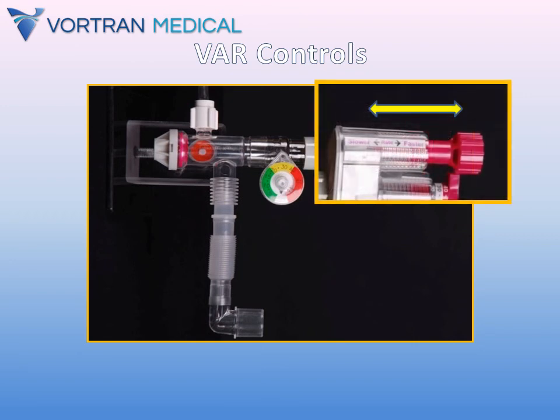Lastly, the round rate knob acts as an expiratory resistor, controlling the rate at which the airway pressure drops and, as a result, the time where the diaphragm will close and allow the lungs to fill again, thus repeating the cycle. You can see by controlling how fast or slow we exhale, we can adjust the overall respiratory rate. Screwing the round rate knob either in or out does just that.